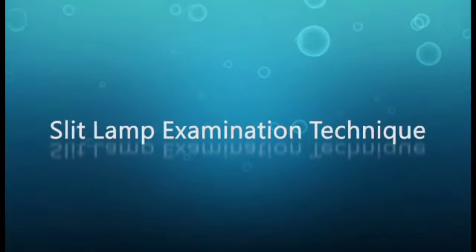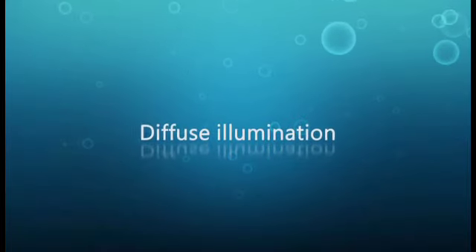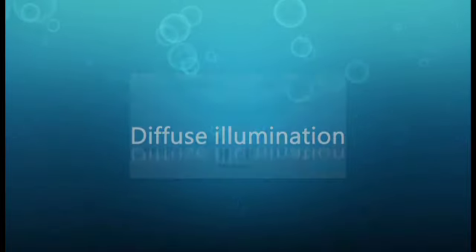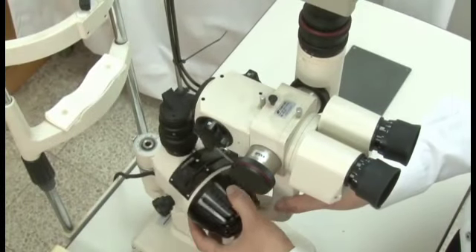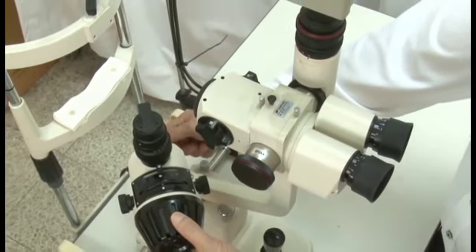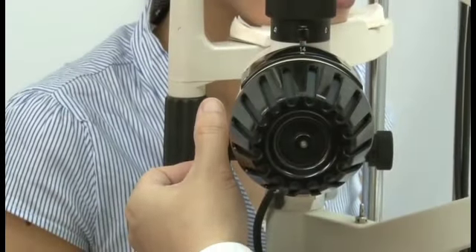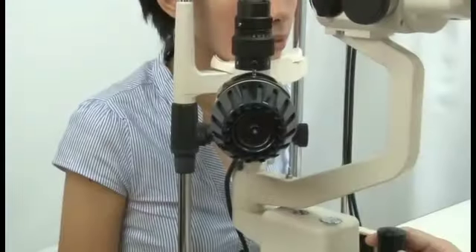Slit lamp examination techniques can be divided into 3 categories according to the type of illumination. First type is diffuse illumination formed by using a wide slit beam. First, set the light source and microscope separated by 45 to 60 degrees. Then set the light source as a wide slit beam and to the lowest intensity. Begin with low magnification. If any unusual condition is observed, gradually increase the magnification for more detailed examination.